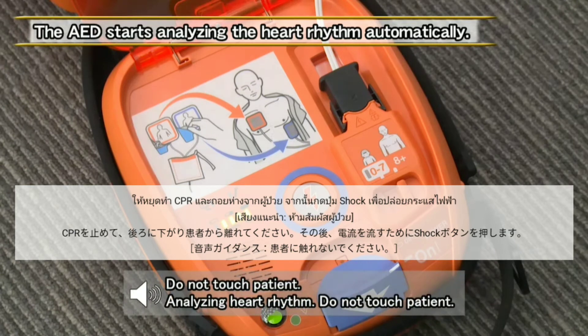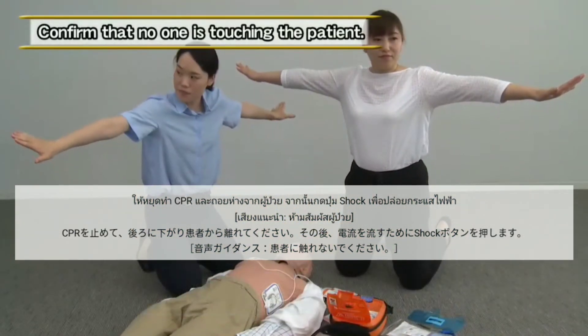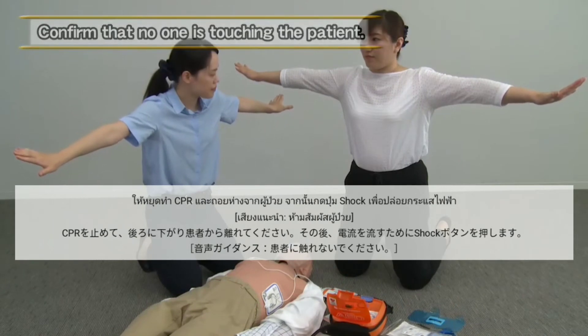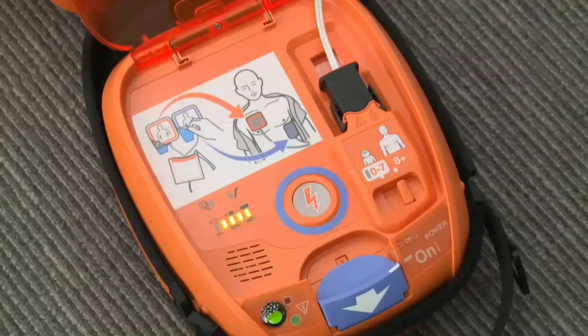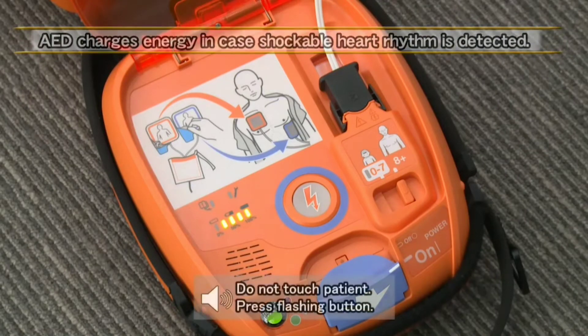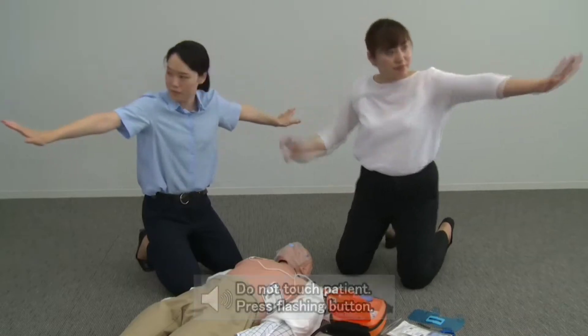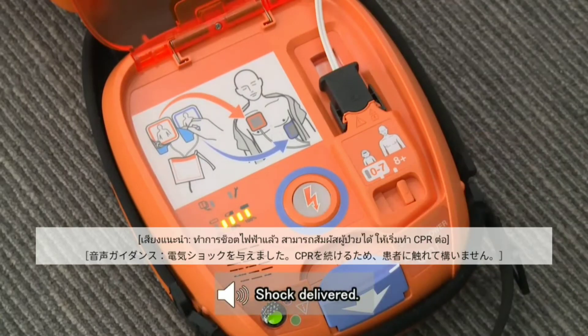Stop CPR and move away from the patient. Do not touch the patient. Shock advised. After confirming that no one is touching the patient, press the flashing shock button. Shock delivered.